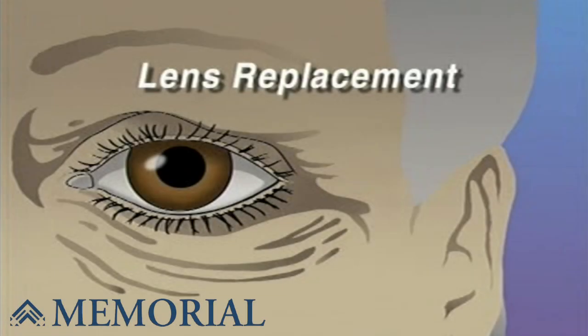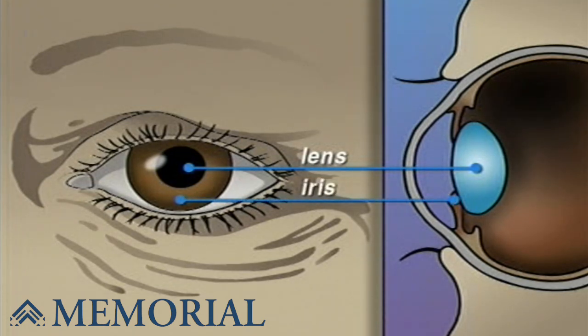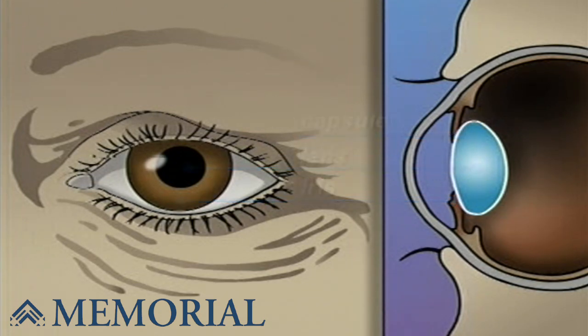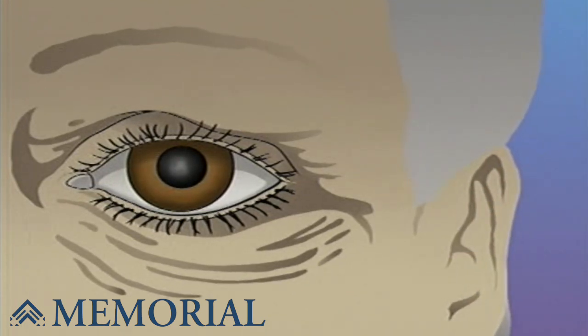Your doctor has recommended that you undergo lens replacement surgery to treat a cataract, but what does that actually mean? The human eye is constructed like a camera, with a clear lens in the front. The lens is located just behind the iris, contained in an elastic capsule. This capsule will serve as the housing for the new lens.